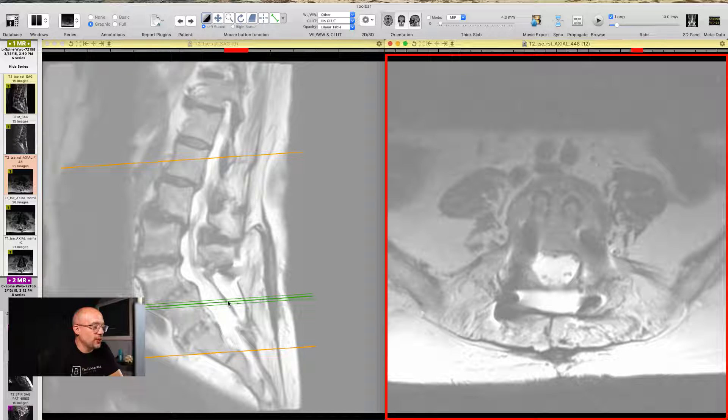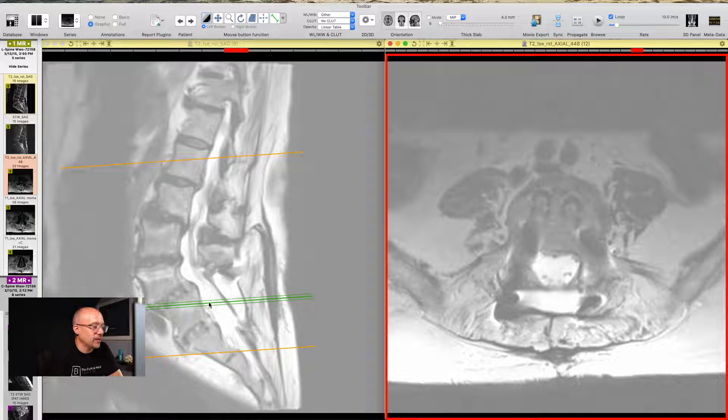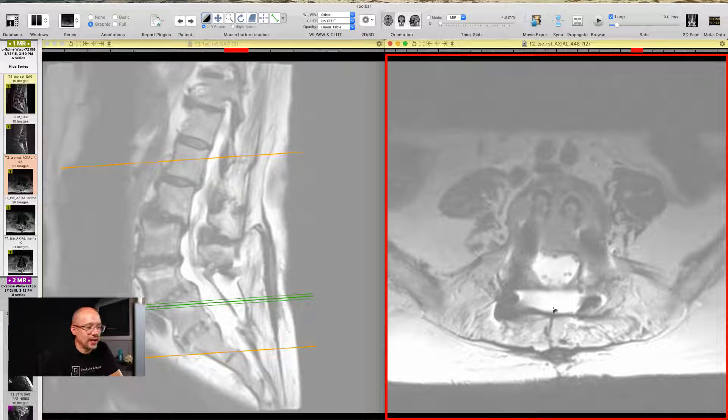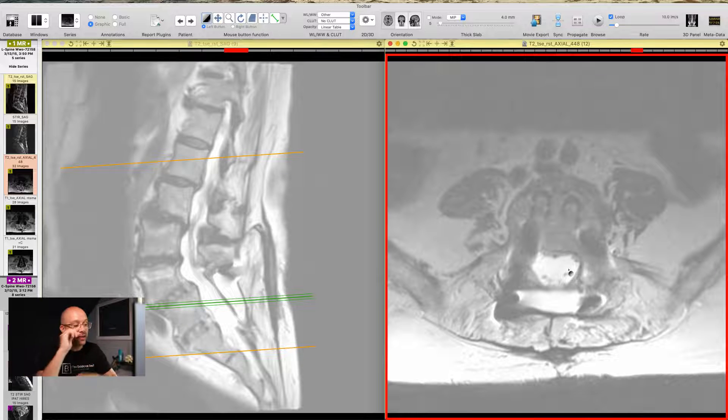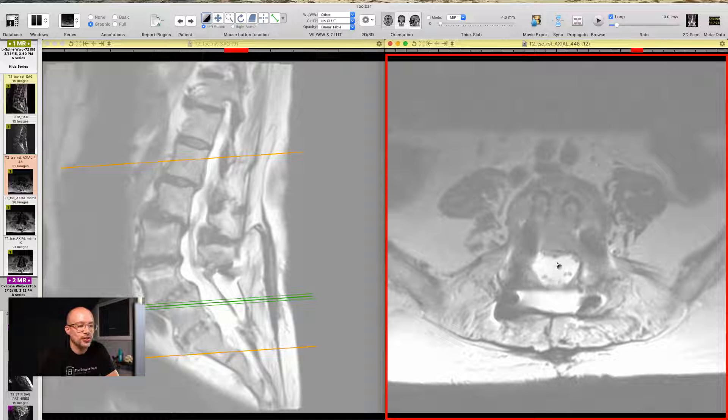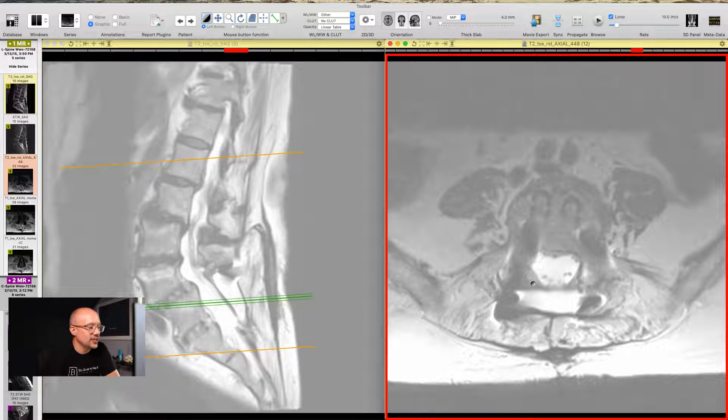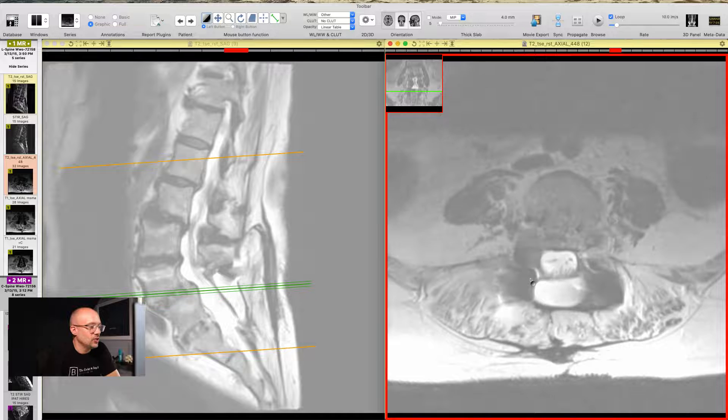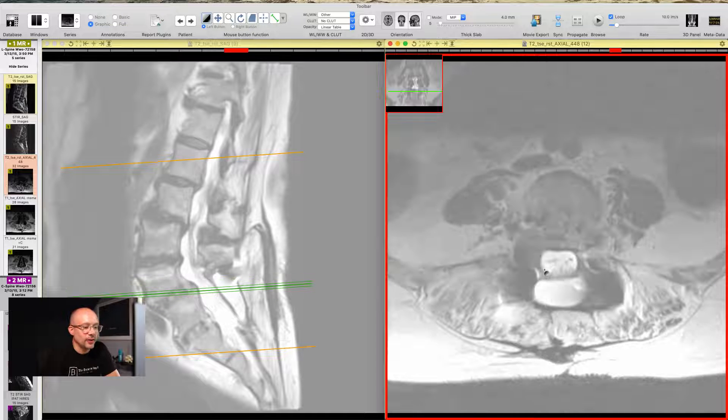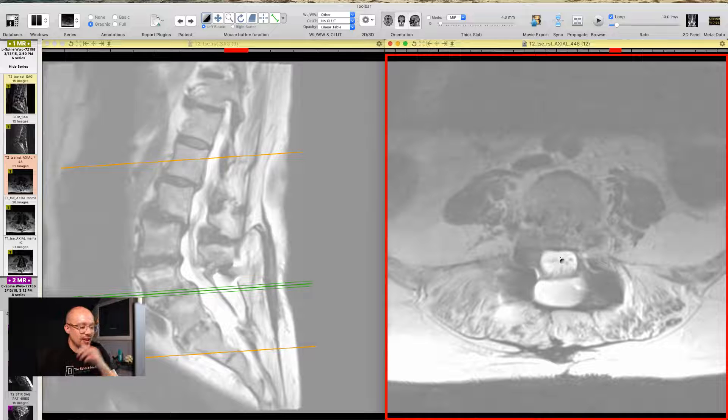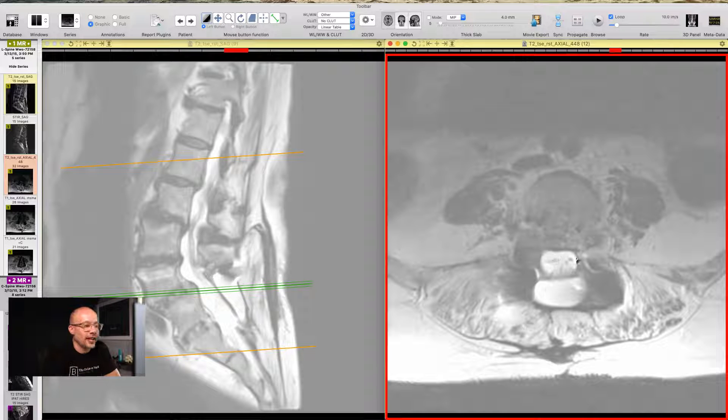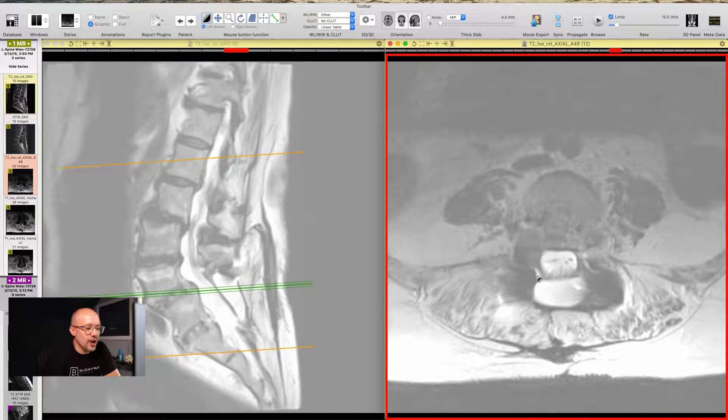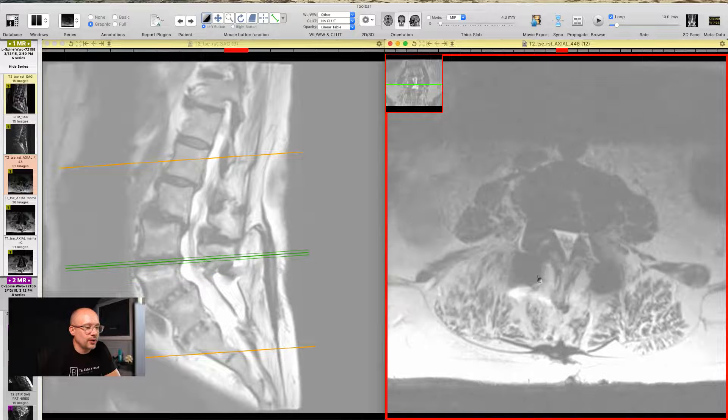So again, we go back over to the left hand side of the screen. We can see right now, oh boy, we're right there. We're right where that fluid collection is in back of the spinal canal. You see that right here. Now the spinal canal looks wide open and that's fantastic. You can see how tall it is here and how wide it is across. It looks fantastic to continue up to L4-L5. You can see that again, fluid collection sitting right behind, right next to that spinal canal, but it looks great overall as we continue to go up.